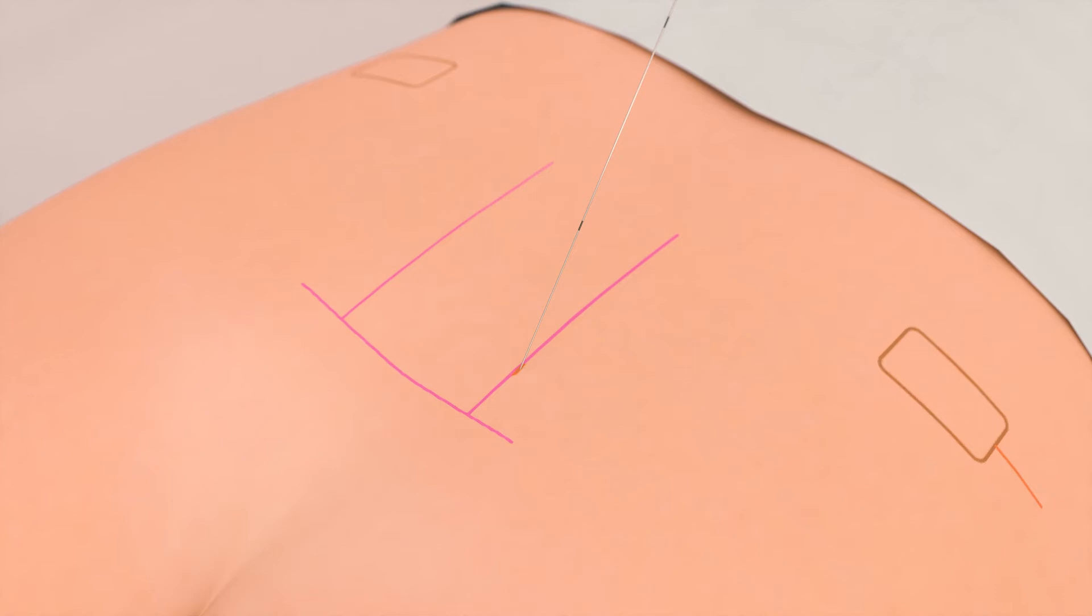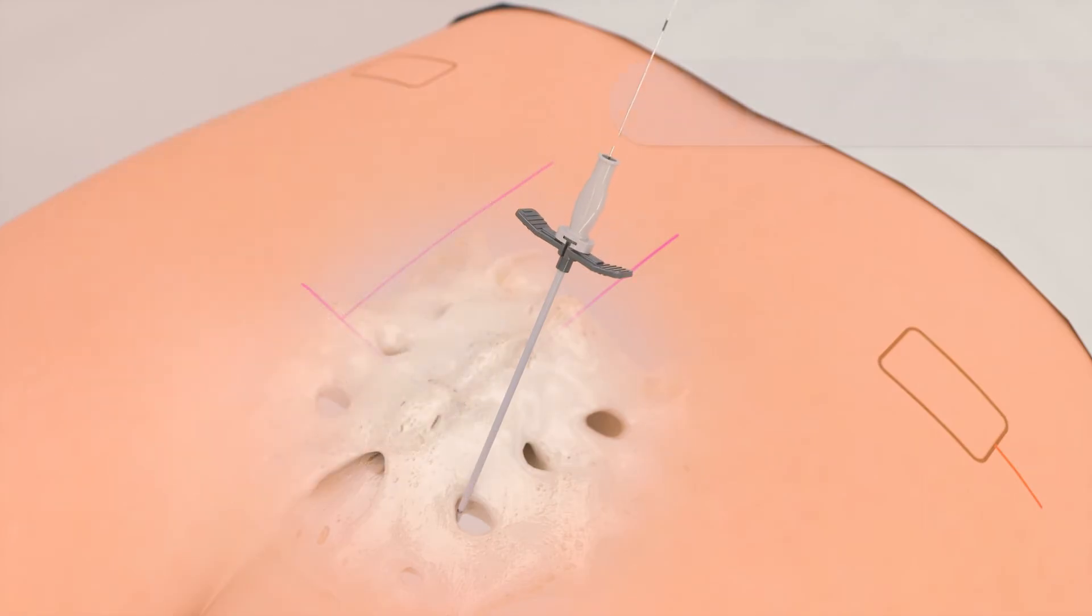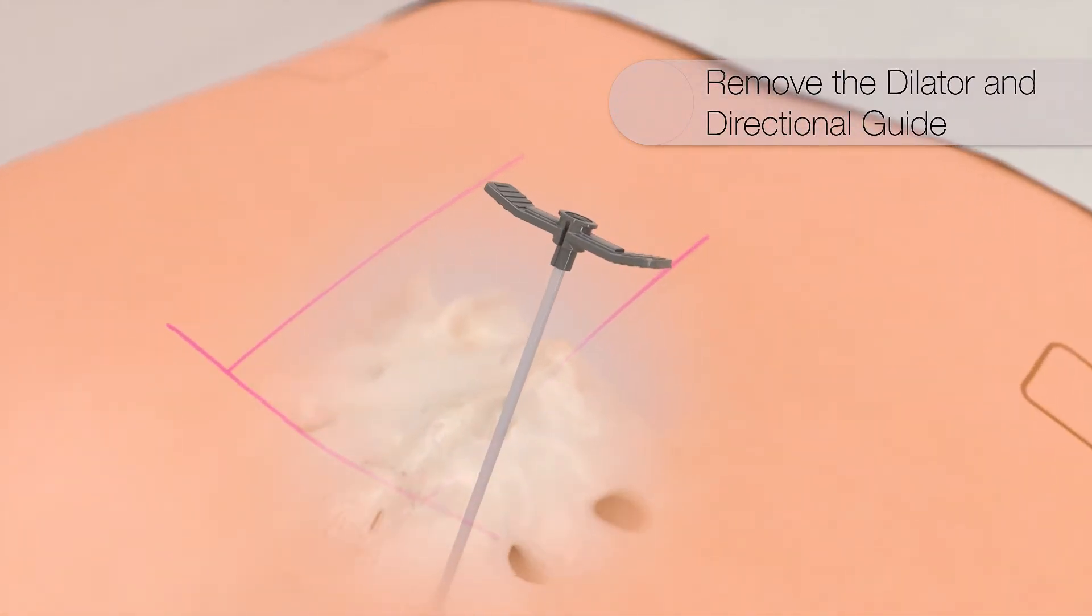Under live fluoroscopy, the introducer is carefully placed over the directional guide and inserted until the indicator is just halfway through the sacral plate. The dilator and directional guide are removed from the introducer's sheath.